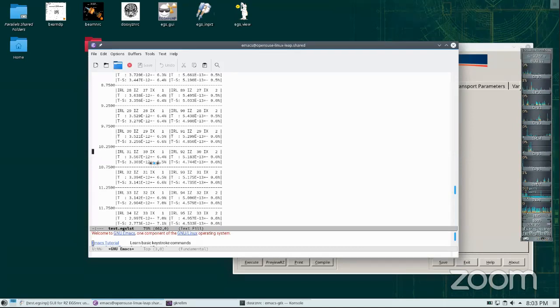The smaller the region, the more particles you need. So for example, you can modify this file and change the radius from 0.5 to 0.25. Then you will find you need to simulate more histories to get uncertainties similar to those you obtained with 0.5. So this is another way to look at these uncertainties. Clear?